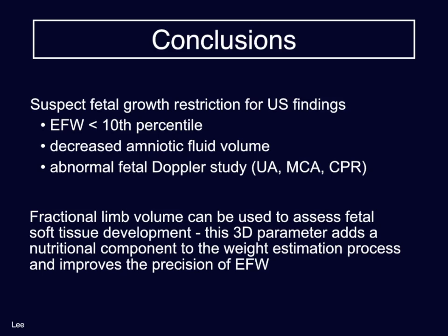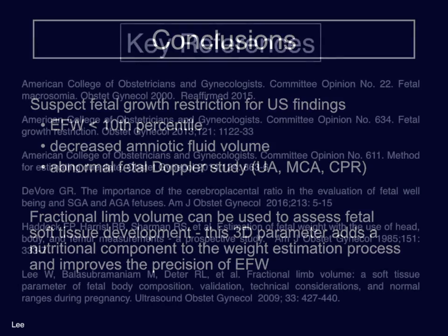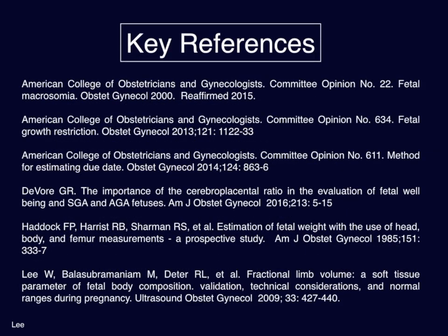Finally, fractional limb volume, when used with 2D biometry, improves the precision of EFW and now adds a soft tissue nutritional component to the weight estimation process. This concludes my presentation on fetal growth, and I have listed a few references for those interested in further reading.